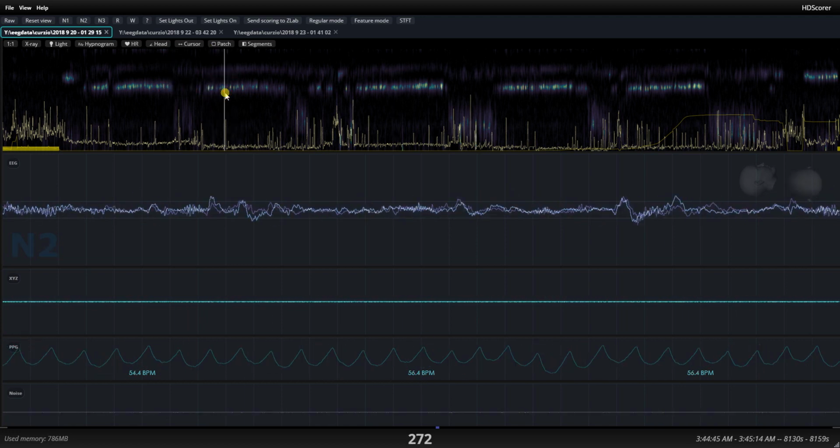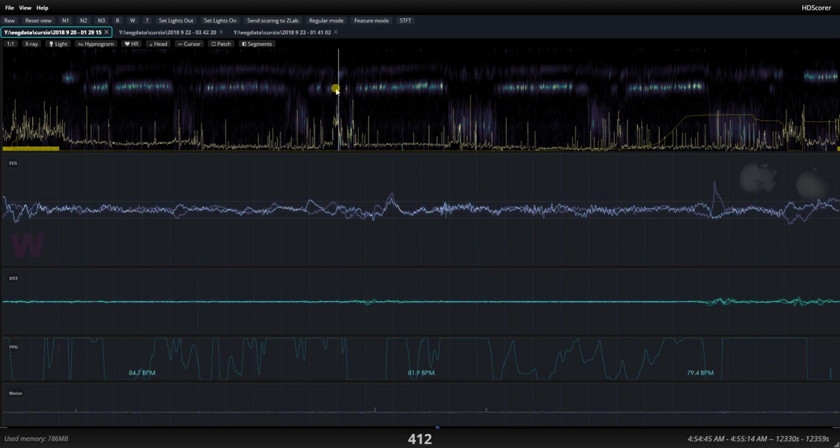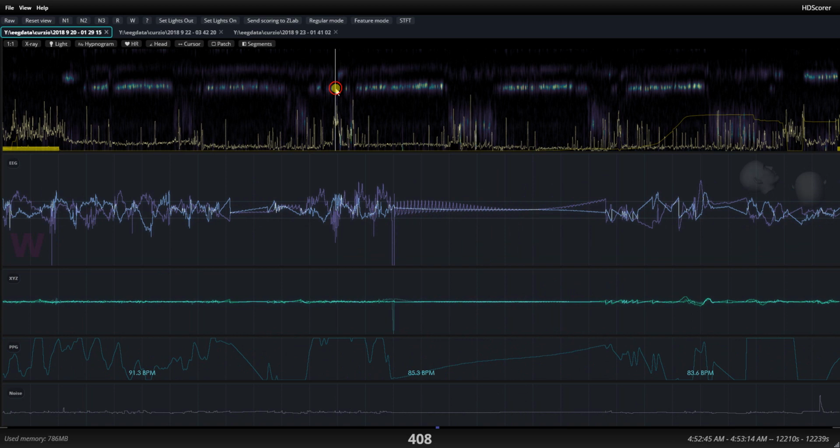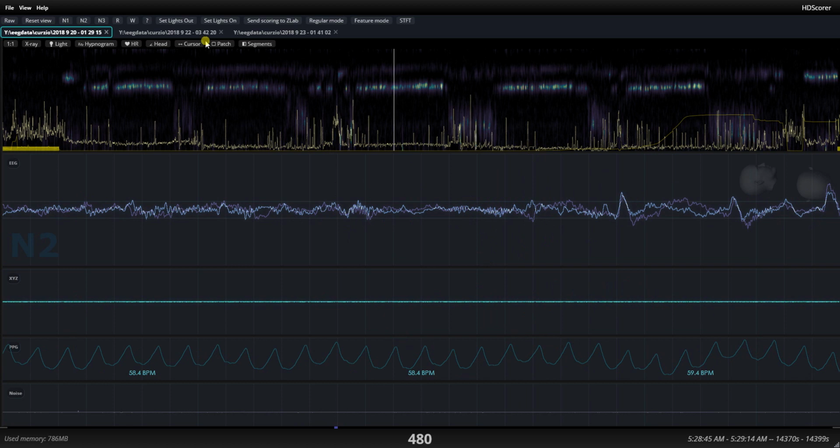For example, if you have accelerometry that tells you that the patient is moving a lot, then you know that whatever you're seeing above on the EEG is garbage. So you wouldn't think that this is delta waves or anything like that, because you know the patient is moving. But to have only this and not this, that's just not going to work.